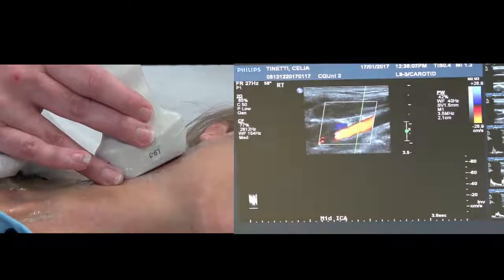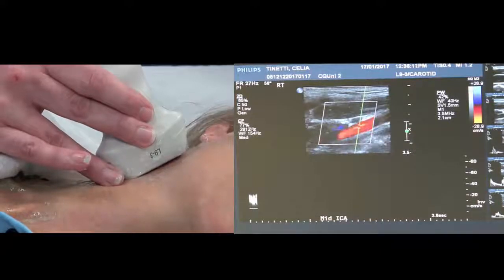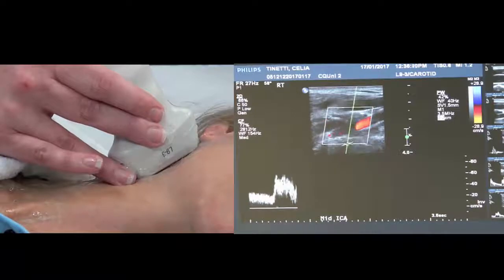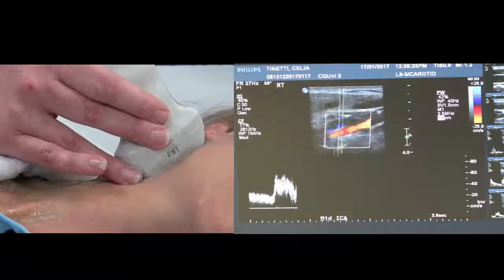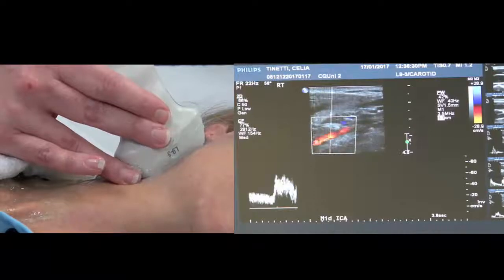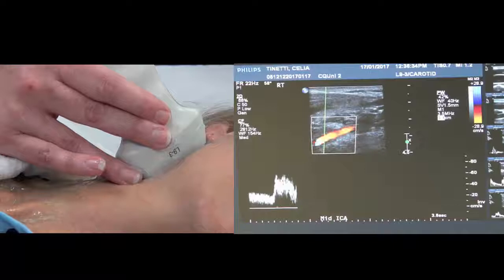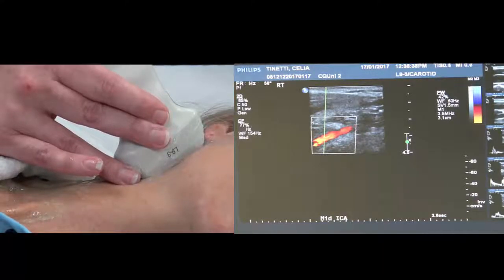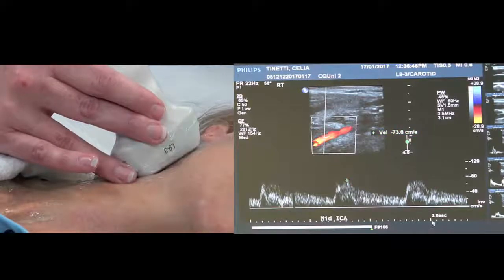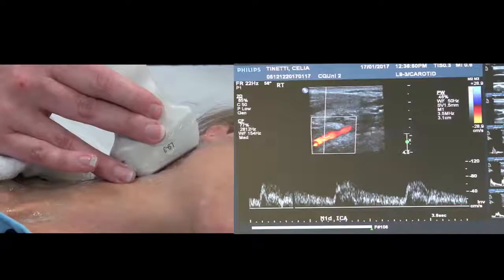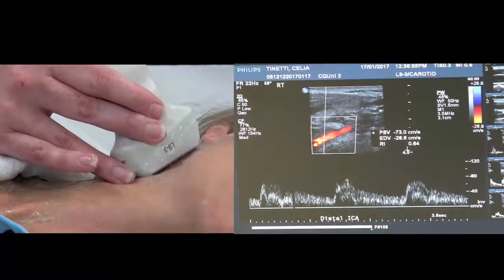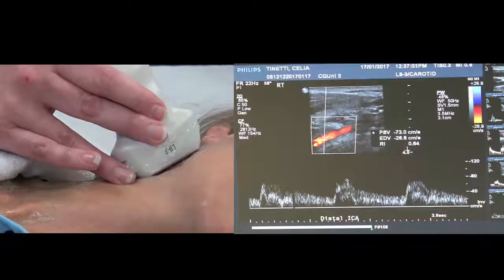For some people you may need to change the speed that it's going at. Now we're going to go distal — as distal as you can. As sonographers, your tutors know exactly when something's distal. Some people you won't get it distally, but if you can get it there where it's starting to duck down, I'm really happy with that. If you can get it there, I'll be giving you a big smiley face if I'm assessing you. Might have to put the scale up a bit. Let's get rid of that and start again — you might need to adjust the scale but I know it will be close. Maybe a little bit more gain in that image, but I'm actually happy with that — that would be a satisfactory image.